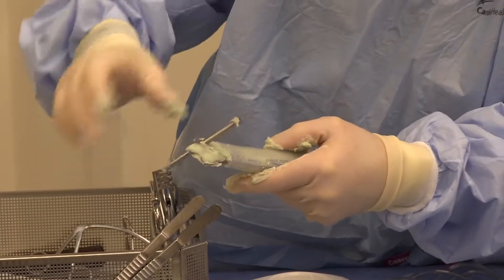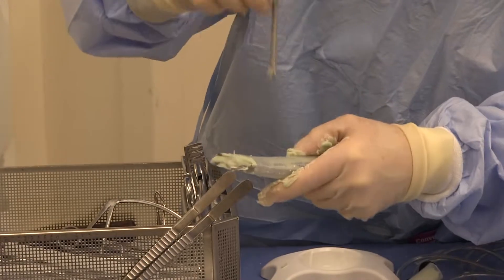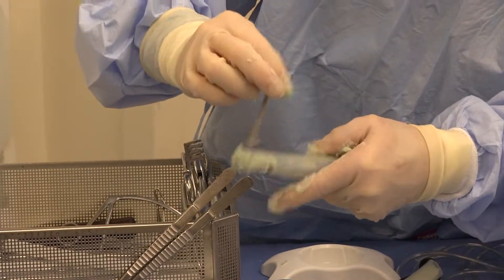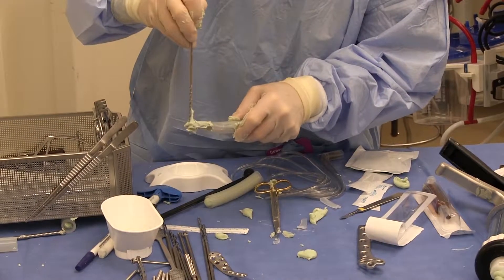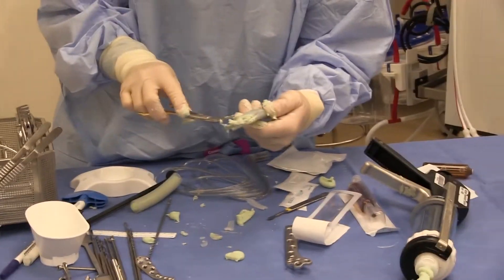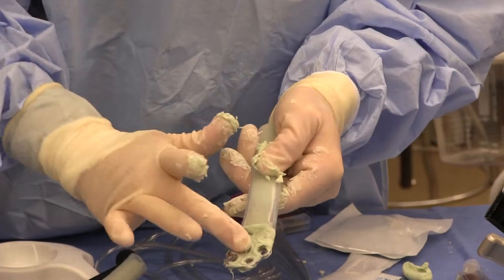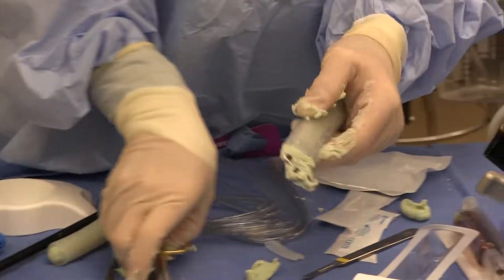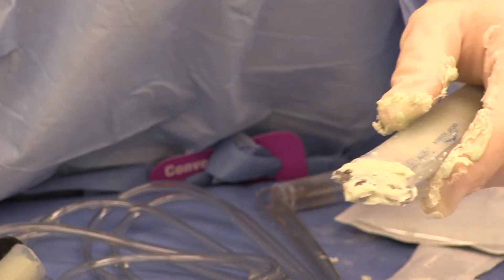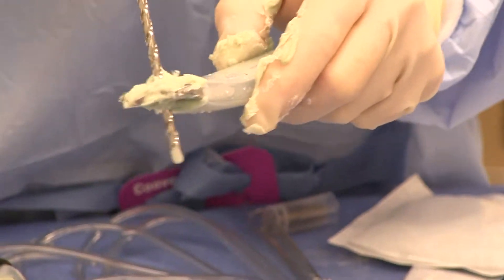When it's doughy, it's pretty easy — you can keep your cement. If it gets hard and you want to still use your locking screws, you can use a drill bit and just drill them out before you use it. It might be easier to put the drill bit in and wipe it out a little bit, then cut the excess off the top. Even with this fat plate, I still have some pretty good coating on the bottom and on the top. It's not too fat.